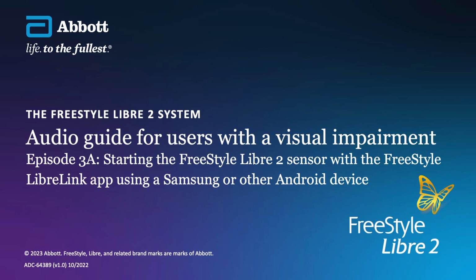Move the phone slowly from top to bottom until you feel a vibration. This means the app has successfully located the sensor. Hold it still until you feel a second vibration and hear a tone. This means the app has successfully read the sensor. The app will now start a 60-minute countdown, after which you can take your first reading.